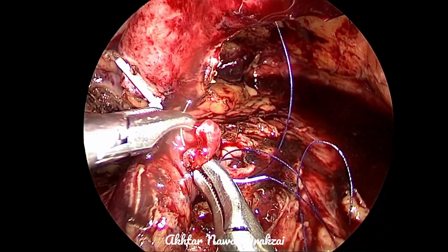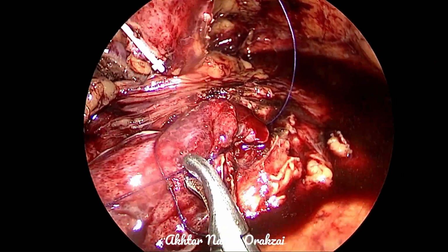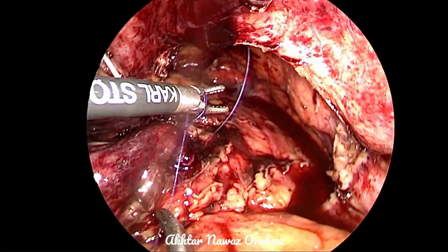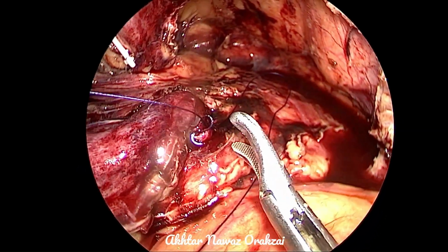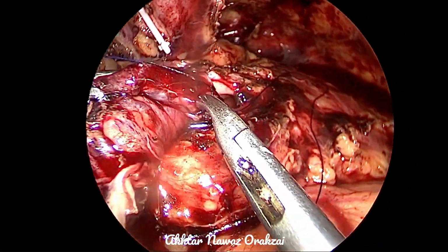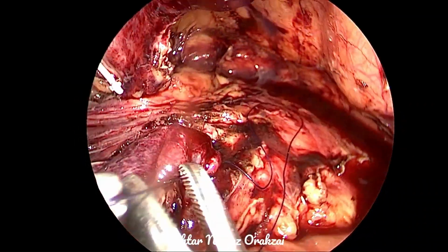This is a nice place to take the stitch. Nicely done.